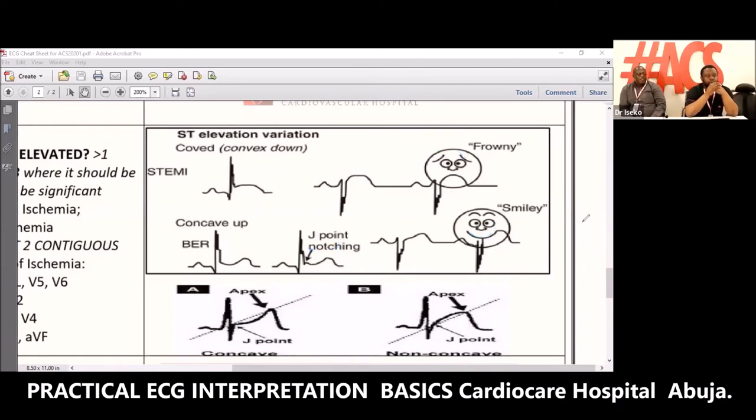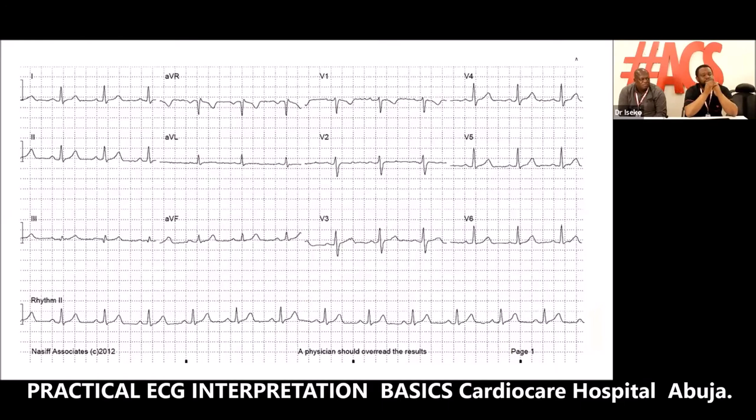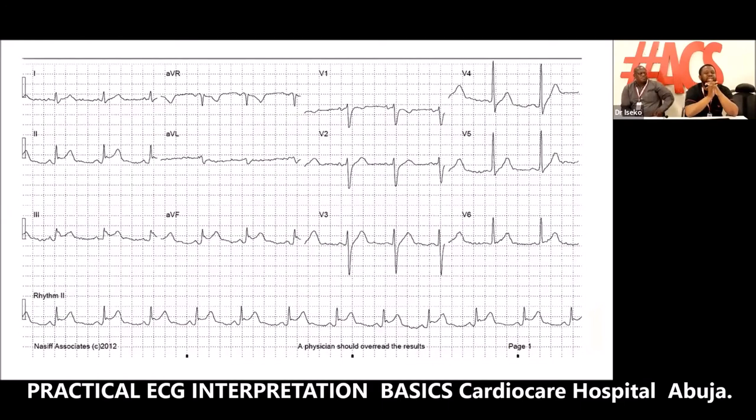Maybe you should check an ECG that has this. Okay, let's go to our ECGs, so that we can all look at it. Go back. All right. Who can read this ECG? Is there ST segment depression or elevation?